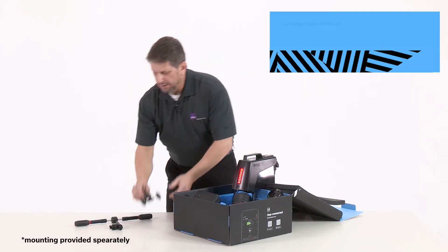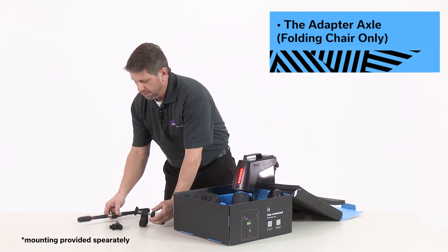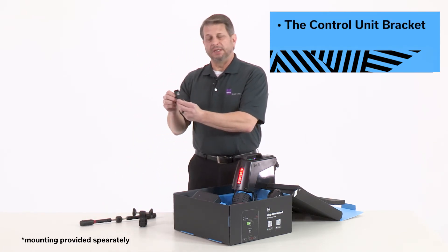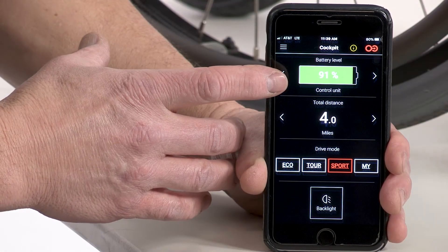In addition, you will need the bracket for a rigid frame chair or the mounting bracket for a folding frame chair. And last but not least, you will need the bracket for the control unit, and you also need the Smoove One app.